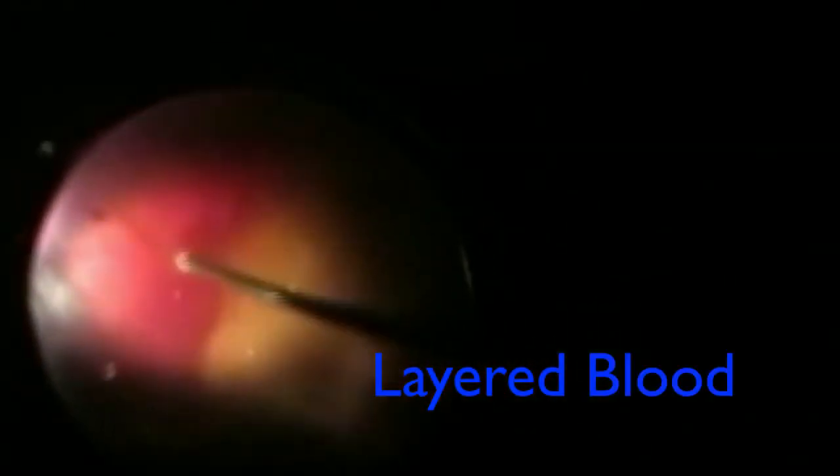I'm going to try to clear some of this layer of blood, and there are different ways of doing it. Some machines have what's called a reflux ability, where it pushes out a plume of fluid and then you can evacuate the blood. I'm very carefully and methodically clearing off the layer of blood so I can get a better view, and then the decision becomes what to do about the scar tissue on the nasal side.